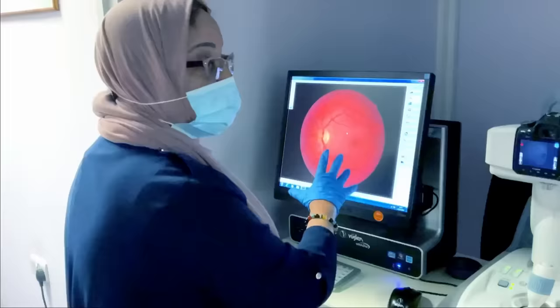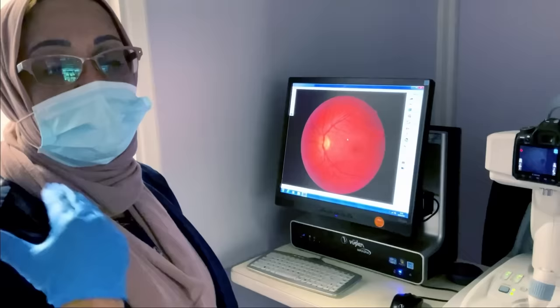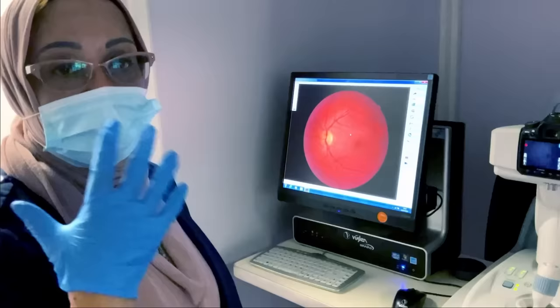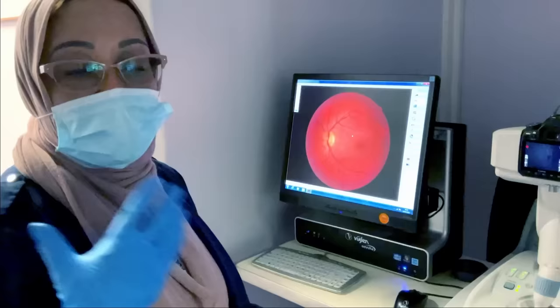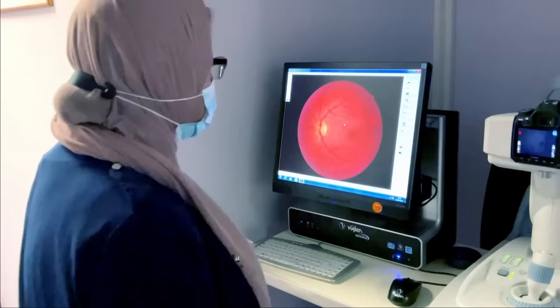It's bright pink because of your race, you're white Caucasian, so your retina is a lot pinker. If you took the same image of me, I'd be a dark pink, more like a tiger type of skin. It's called a tigroid. Whereas this is very pink, because you don't have as much pigment as me. And you yourself are very blonde, blue eyed, so therefore you'll be even pinker. So that tells you of your race as well. That's fascinating.